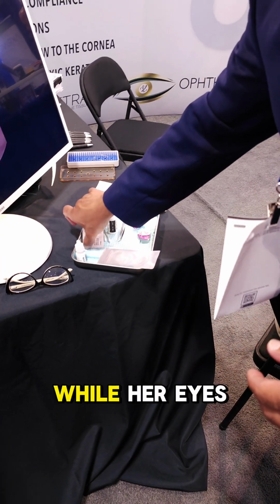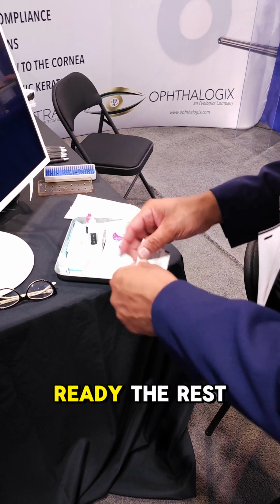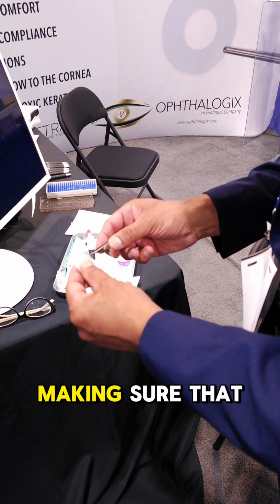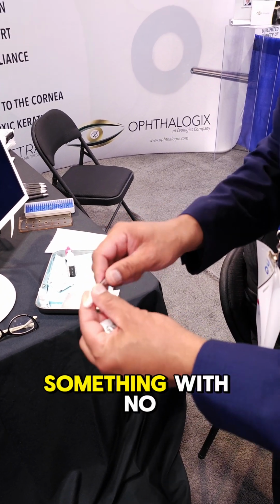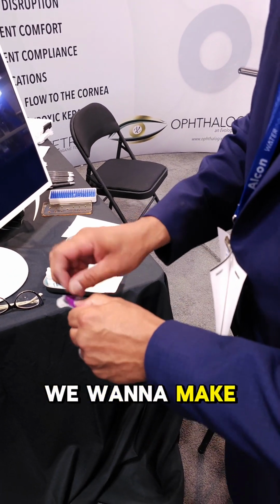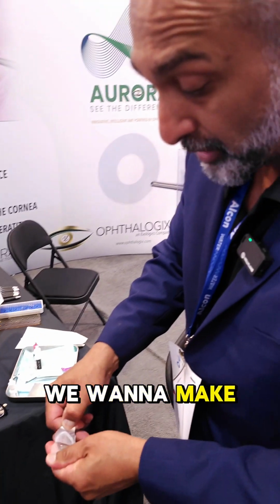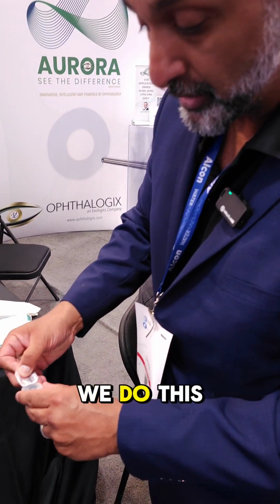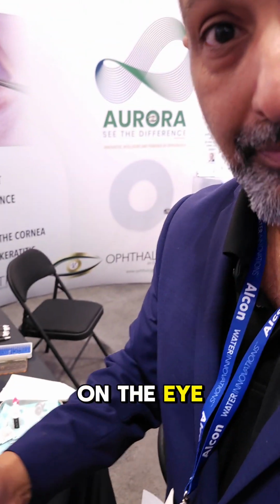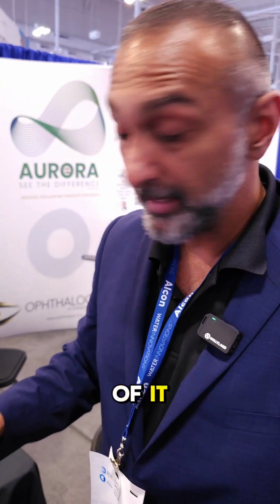In the meantime, while her eyes are closed, we'll get ourselves ready the rest of the way, which is going to mean making sure that our forceps of choice, something with no teeth, it doesn't have to be an angled jeweler's, that's my personal preference. We want to make sure that's ready to go. We want to make sure our bandage lens is ready to go. Now, normally when we do this on a patient, we're putting a bandage lens on the eye. We're putting a membrane on the eye and then a bandage lens over the membrane, and that's kind of it.